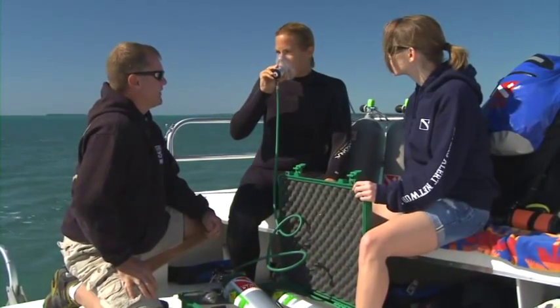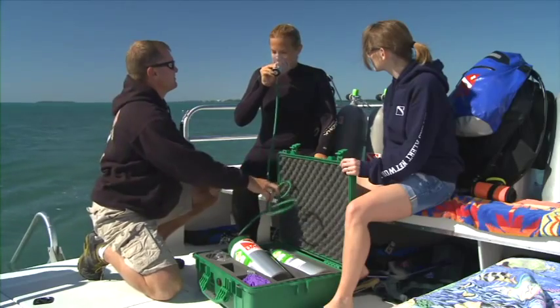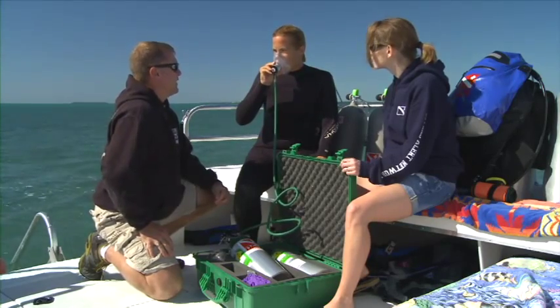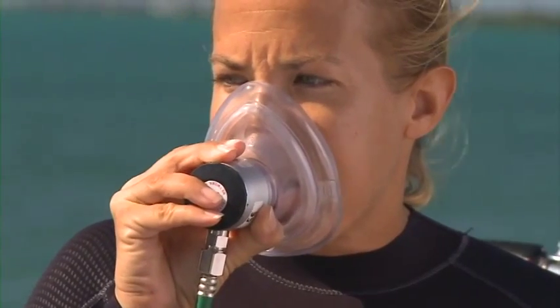If the injured diver is unresponsive, permission to help is assumed. Place the mask over the injured diver's mouth and nose and instruct the diver to breathe normally. Comfort and reassure the injured diver and listen for the demand valve to activate. Observe the mask fogging during breathing and watch the chest rise and fall.